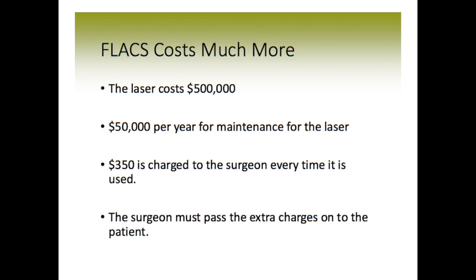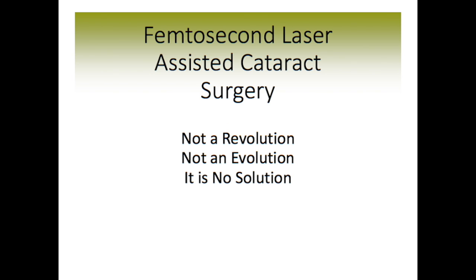And so there's a considerable out-of-pocket expense for the use of this laser passed on to the patient. So at least in its current state, I like to say about FLACS that it's not a revolution as marketed to eye surgeons. It's not an evolution. It's really no solution at this point.